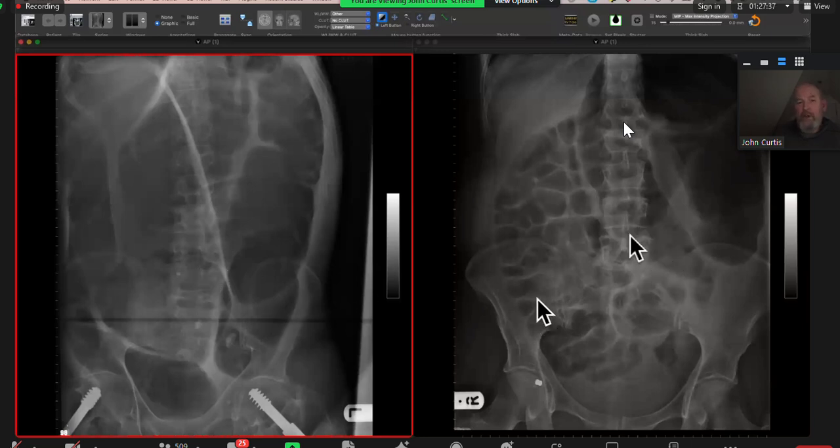So in a cecal volvulus, the problem is in the ascending colon mesentery. It twists on the mesentery, and the cecum then moves into the left side over here. And then the space that's vacated by the cecum is filled with small bowel, which may or may not be gas filled. But a cecal volvulus, in effect, does give you small bowel obstruction because you can't get past the cecum, because it's twisted.